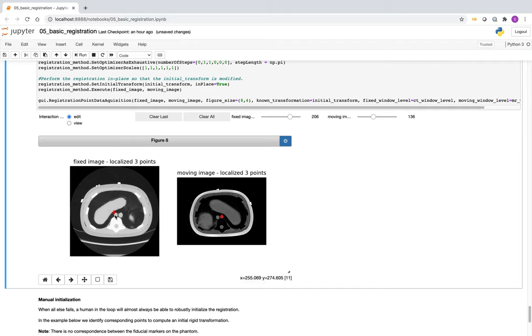Registration errors are task-dependent. This result might be good enough if you're only interested in the top of the lungs. If you're only looking at one lung, everything's fine. If you're looking at a specific problematic region, it may not be acceptable. You need to understand the spatial distribution of your target registration errors.